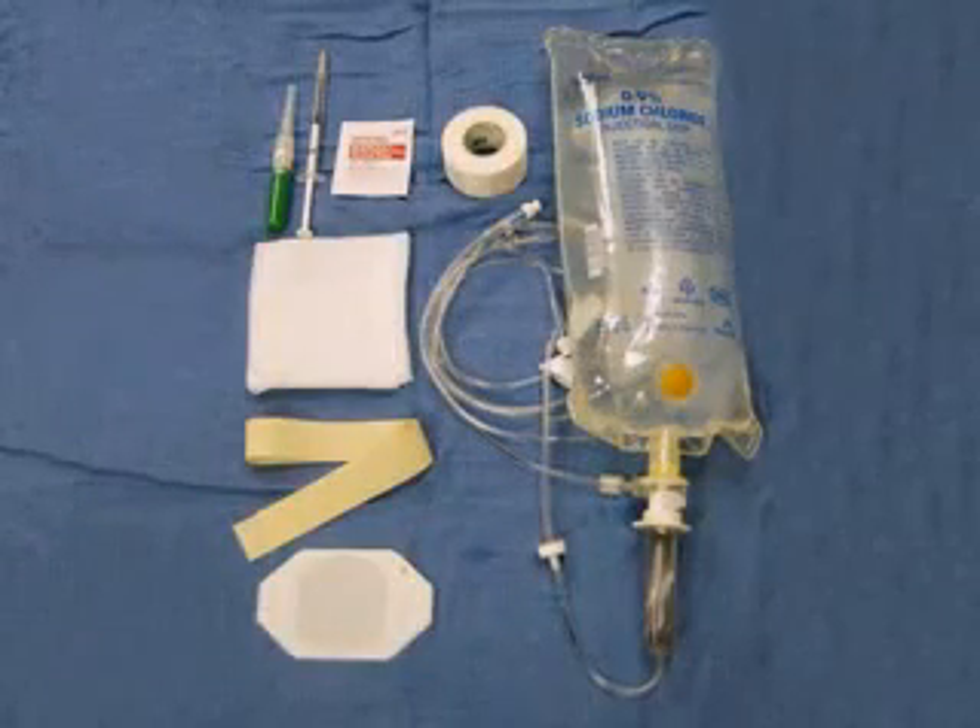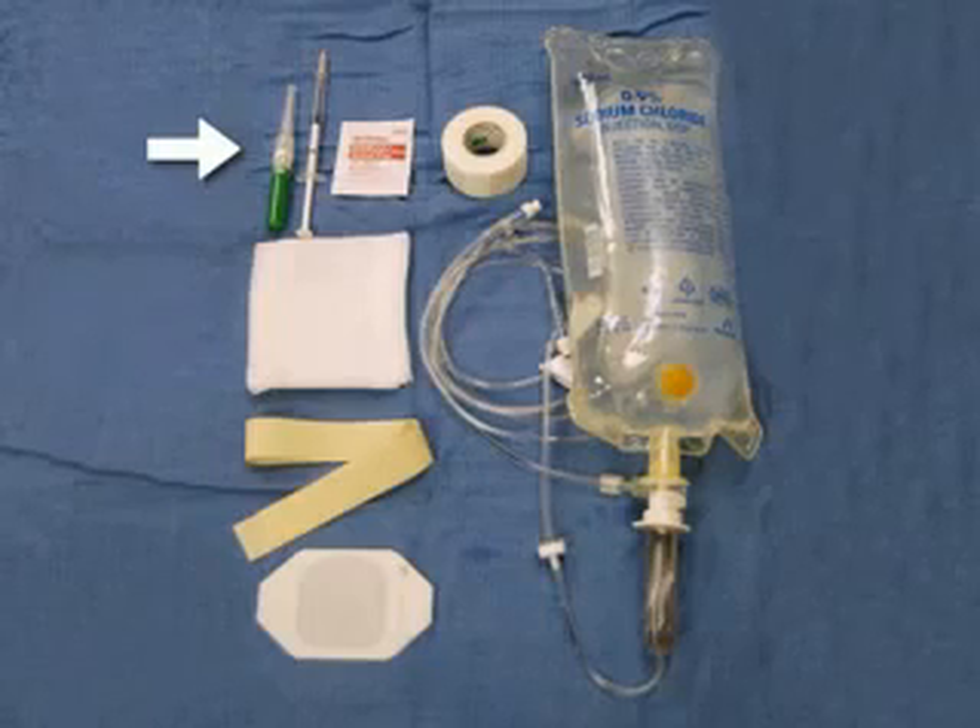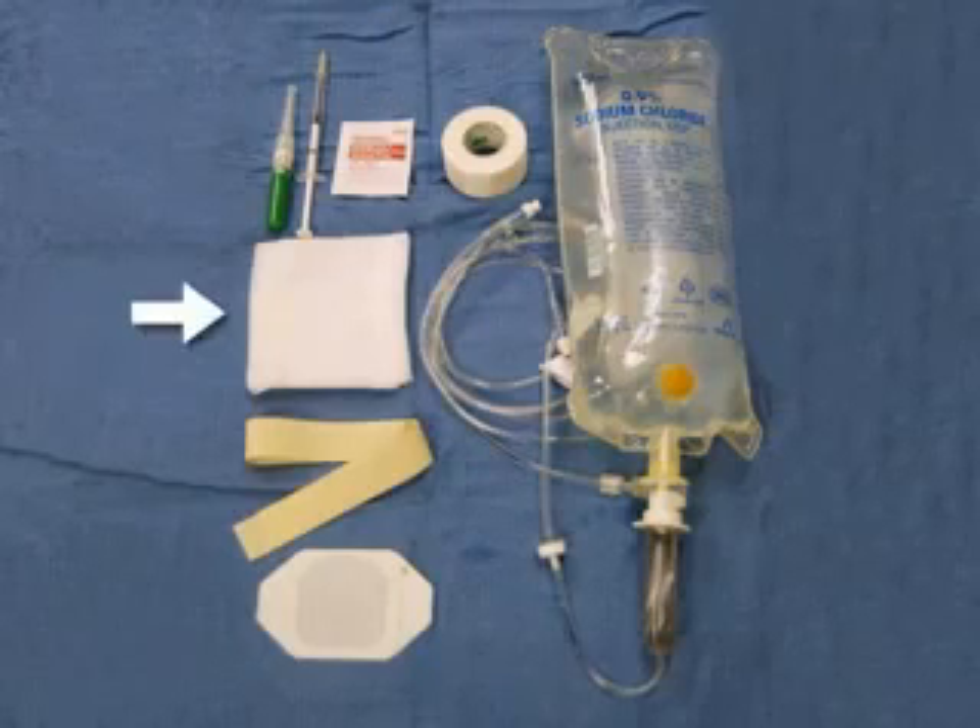Preparing your equipment prior to starting an intravenous catheter promotes both efficiency and effectiveness. Lay out an appropriately sized catheter, 1% lidocaine in a tuberculin syringe, alcohol or chlorhexidine swabs, tape, gauze, an IV fluid bag with connected tubing, a tourniquet, and tegaderm. Keep the equipment within easy reach.